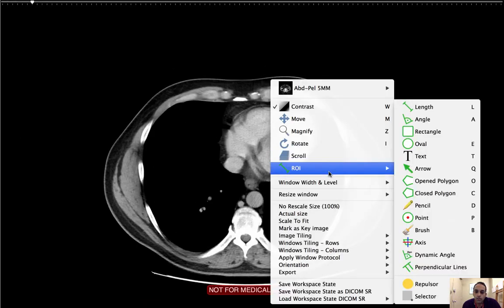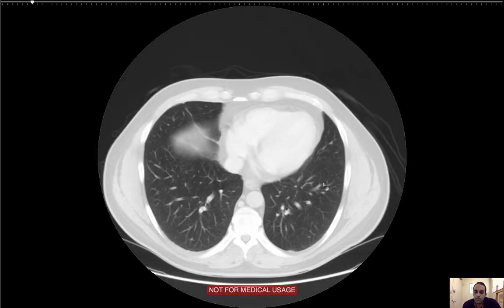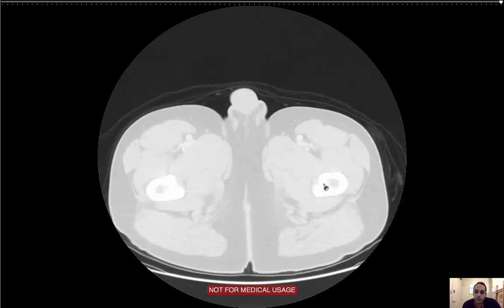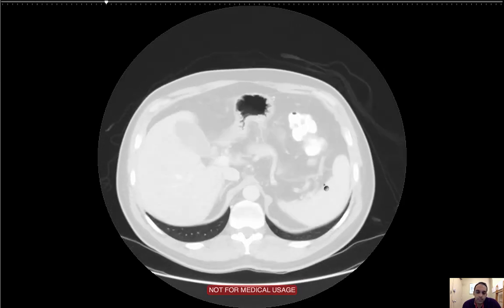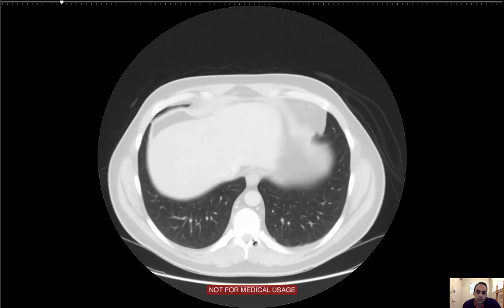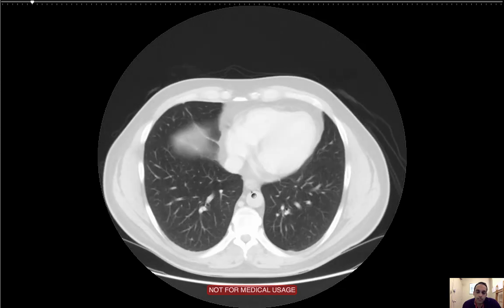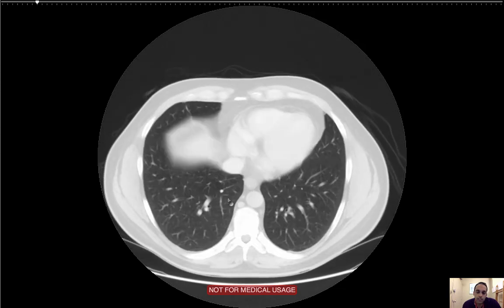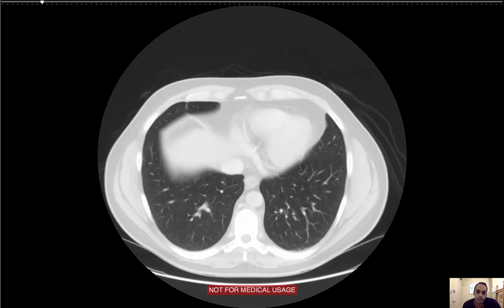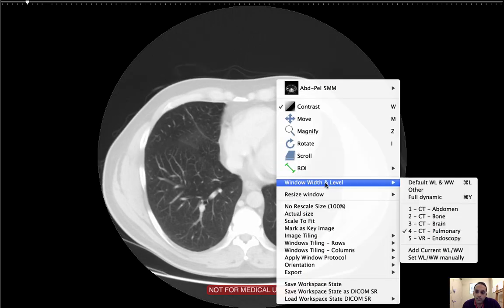I'm going to start with the lungs, looking at lung windows. I'm looking at each lung, basically looking for effusions or consolidations, pneumonia, congestion, any findings I can pick up — small nodules. I don't see anything. The lungs are clear.